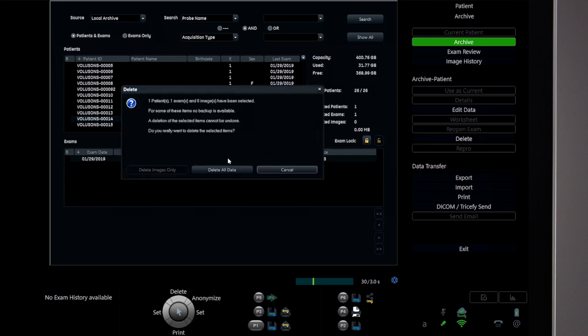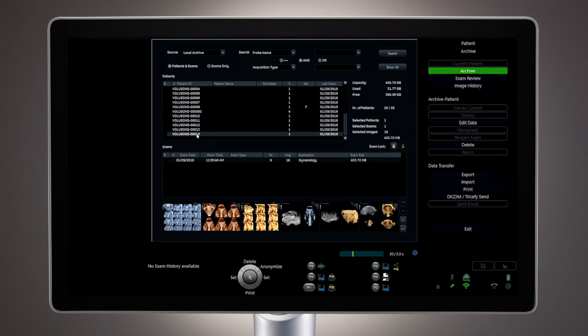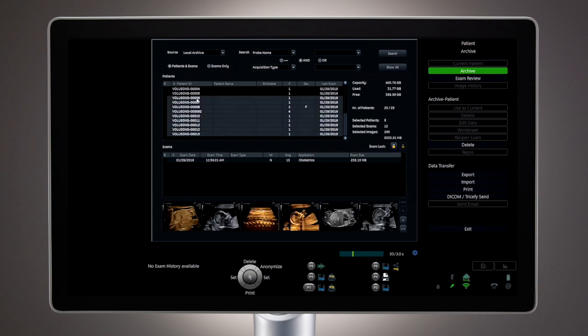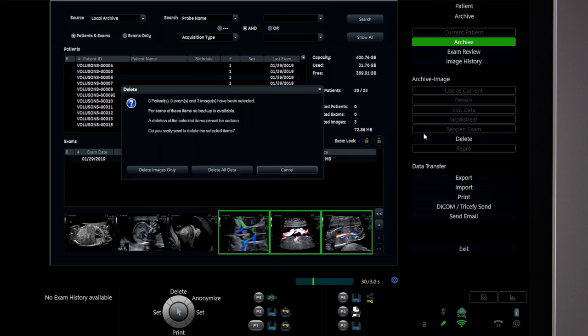Choose All data to remove all patient data and images. To select multiple patients at one time, select and hold the Shift key on the alphanumeric keyboard and select a second study on the list. All studies in between the two selected patients will be highlighted and can be deleted. Specific images can also be chosen from the exam review screen for deletion in the same manner.